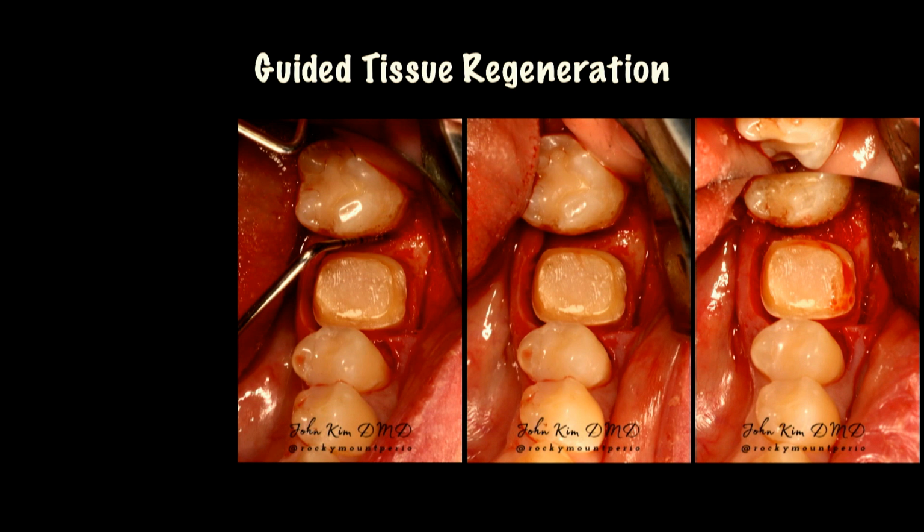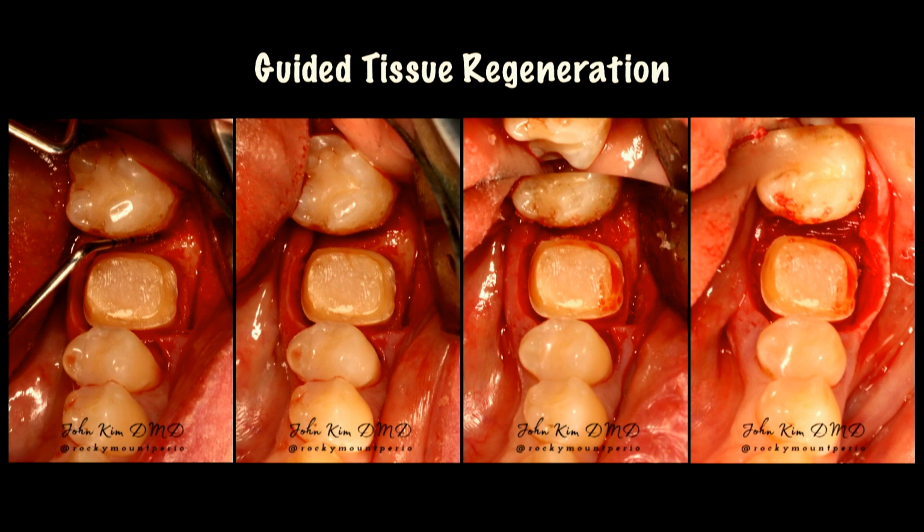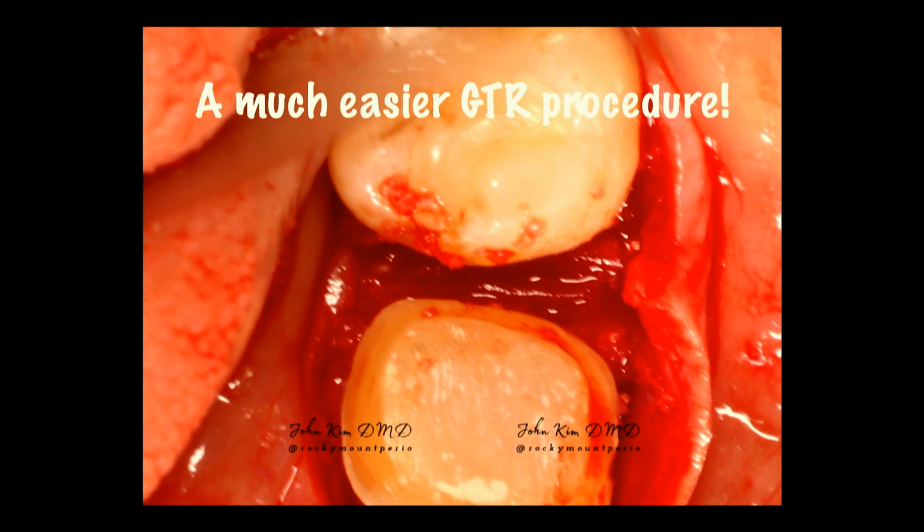And it's hard to see here on the screen. I promise the resolution's a little bit better on my MacBook, but I got the graft in there and was easily able to drape the BioXclude. And there are a lot of other membranes out there, especially collagen membranes, that handle very well. But no matter how well they handle, it's not easy to fit into tight spaces. And this is what I find as a clear advantage in using BioXclude beyond it being a barrier membrane and also a carrier of growth factors, is being able to have something very easy to use when I am doing surgery. So here's a close-up. I'm all about finding ways to make my life easier.